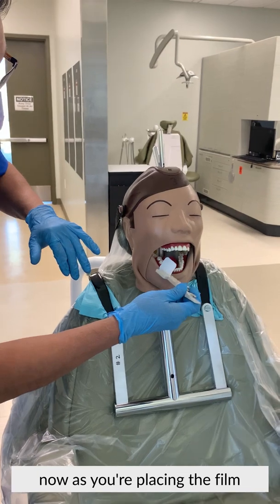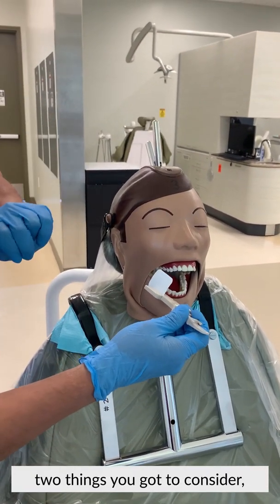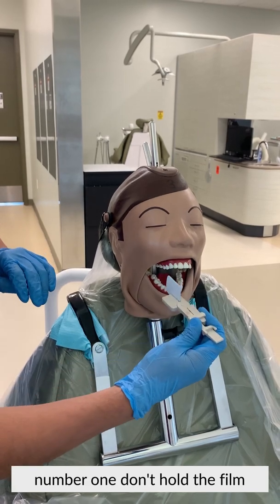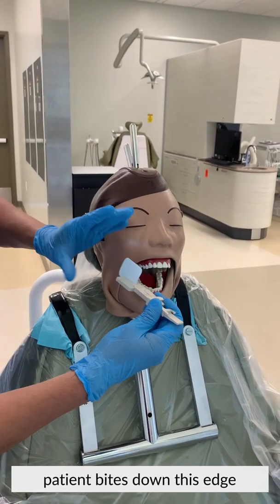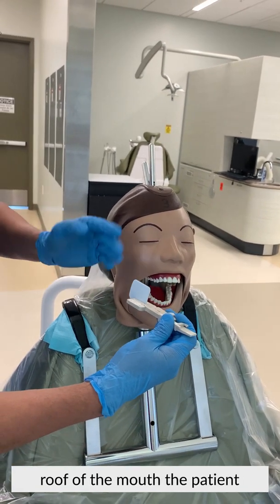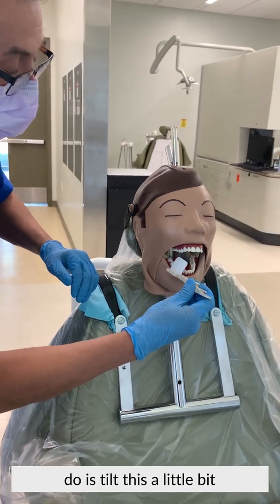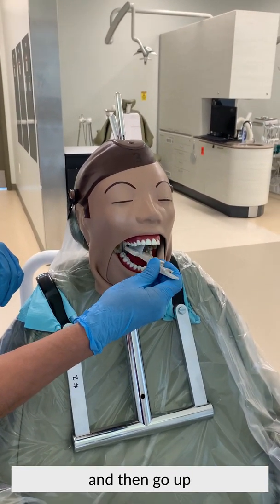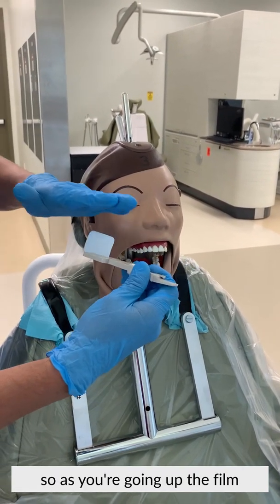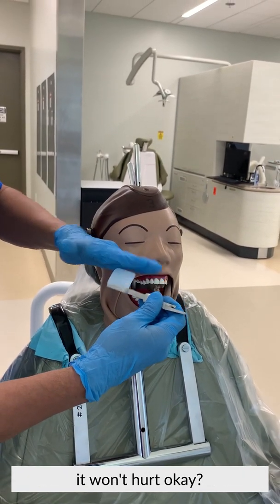Now, as you're placing the film inside the mouth, there are two things you have to consider. Number one, don't hold the film straight up because when the patient bites down, this edge of the film might hurt the roof of the mouth. The patient might say, oh, that hurts. So what you're gonna do is tilt this a little bit and then go up. As you're going up, the film kind of bends a little bit and it's a little nicer for the patient, so it won't hurt.